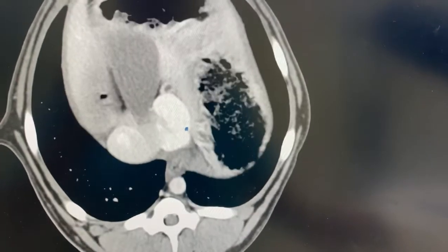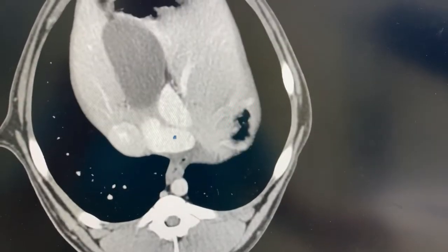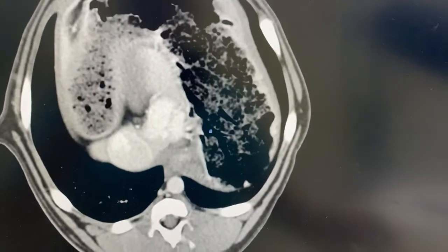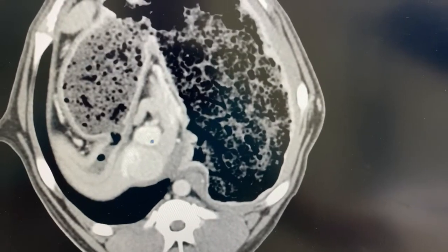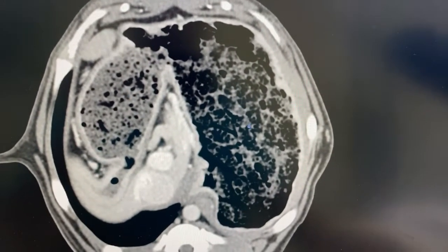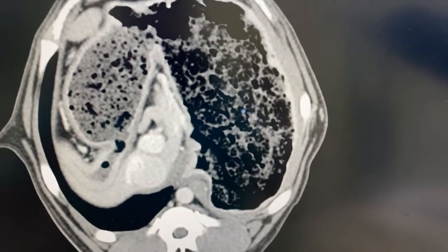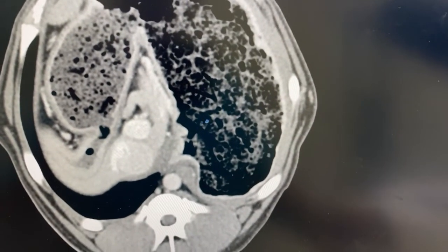That vessel, as you go farther caudal, you can see it looping around here and then joins with the portal vein right there. That's all food in the stomach. It is a Labrador, so you can expect that there's pretty much always going to be food in the stomach.